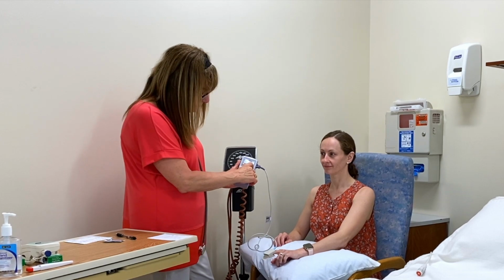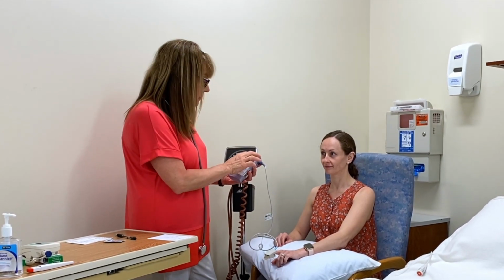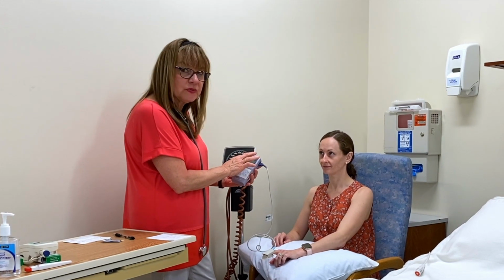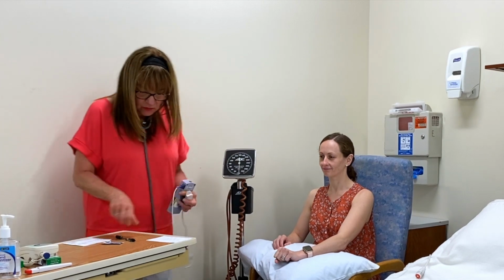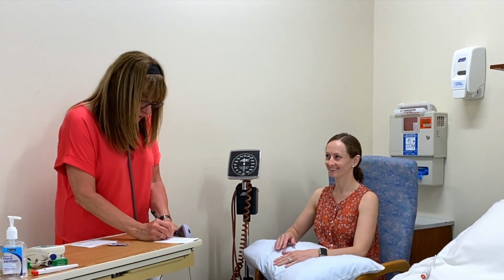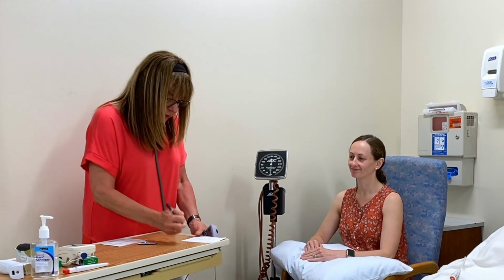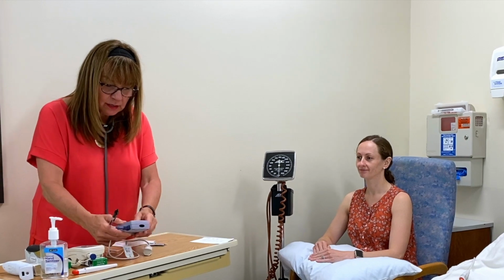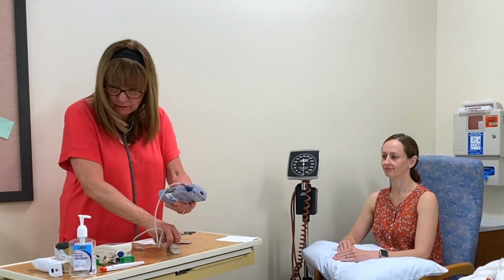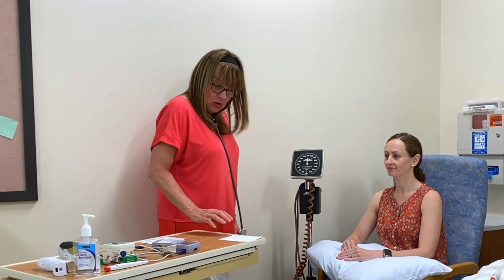Okay? Don't get these numbers mixed up, because clearly the SpO2 is on the left, the heart rate's on the right. 100%. Wow, I don't think I've ever got one that high. Beautiful. 100%. She's on room air. She's not on oxygen. And certainly, definitely within normal limits. So all of her vital signs are within normal limits.